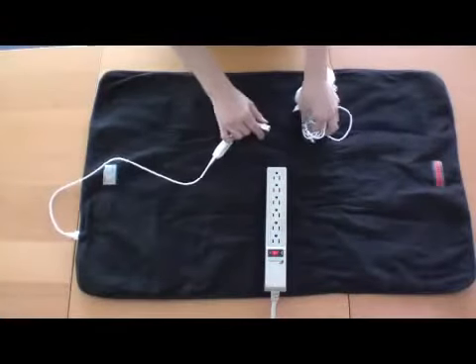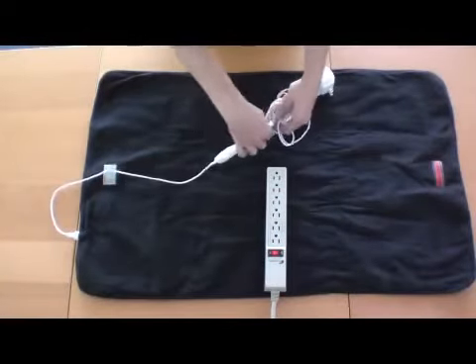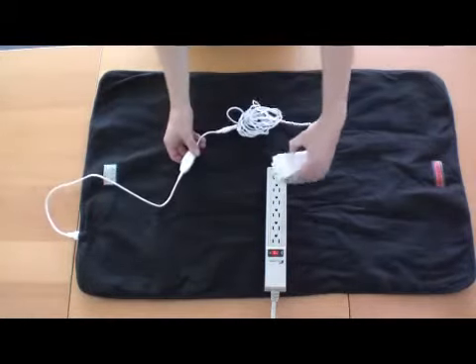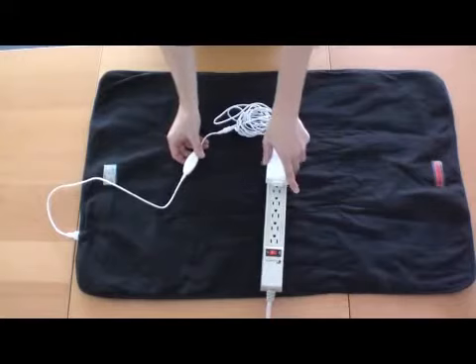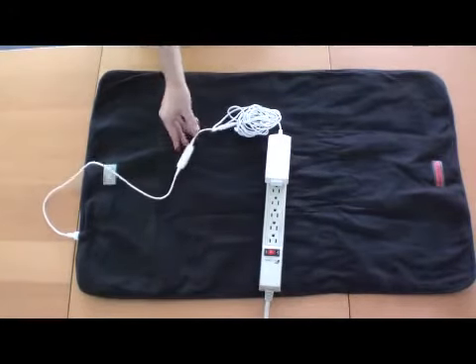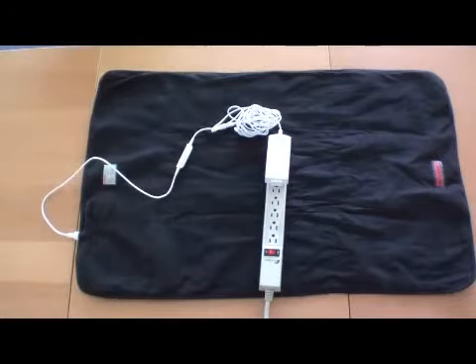Next, plug the controller into the power adapter. Now plug the power adapter into a standard outlet. When this is done, the lights on the controller will flash to indicate power is being received.